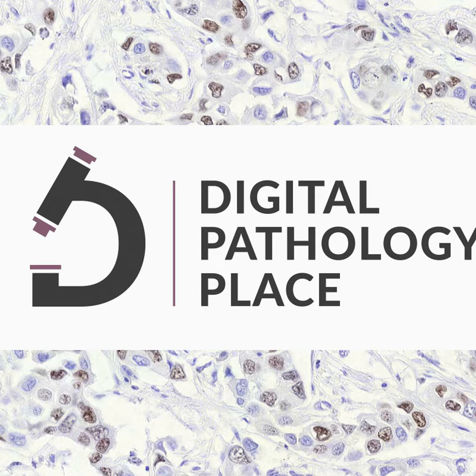But let's step back and ask, what is primary diagnosis? Primary diagnosis is when a pathologist looks at a slide, and through really kind of a miraculous process, the visual information goes in, something happens in the brain, and then, either instantaneously or a few minutes later, or maybe after some tests, some words come out. The words get into the report, and that dictates everything to follow with the patient. So what's in the black box of the brain that's going on?